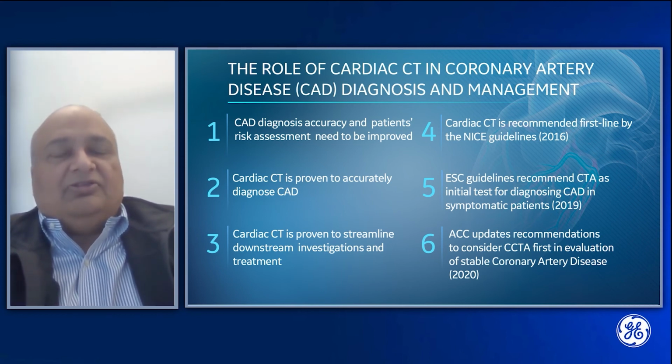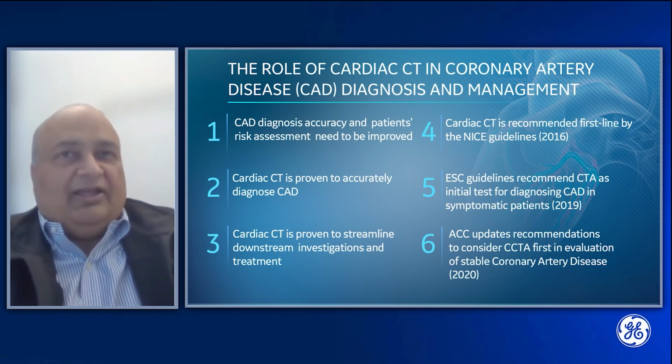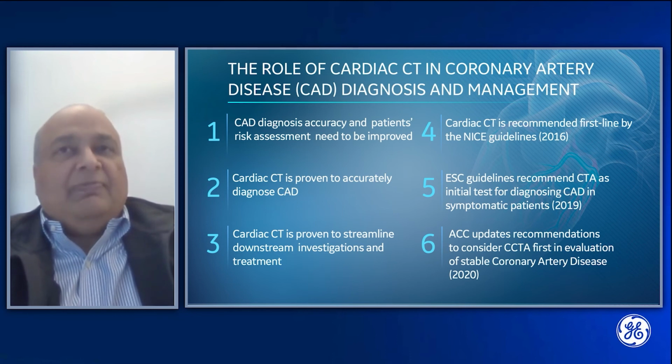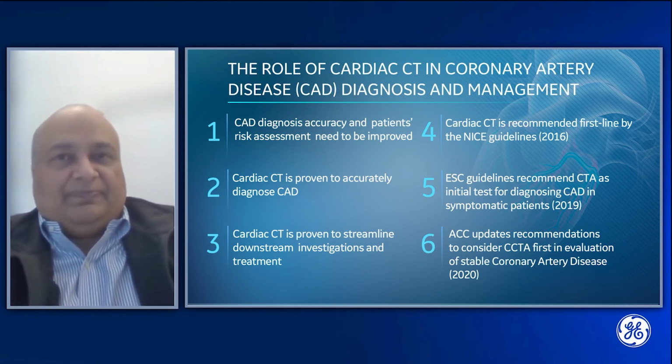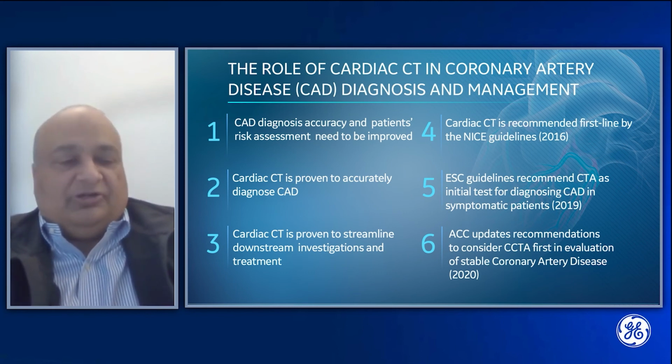What we anticipate with this is a change in the volume of cardiac CT procedures. The biggest thing we want to look at is how we make that transition, so that the increased volume of cardiac CT examinations, their diagnosis and their assessment, becomes more streamlined and the workflow improves. It shouldn't be linked to one specific specialist technologist doing the cardiac scan, and then a very specialist post-processing application. So it becomes much more of a routine procedure.